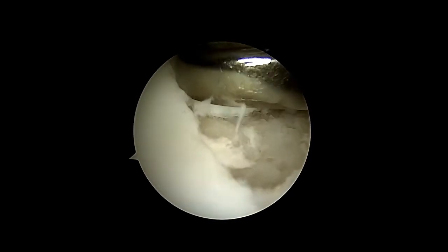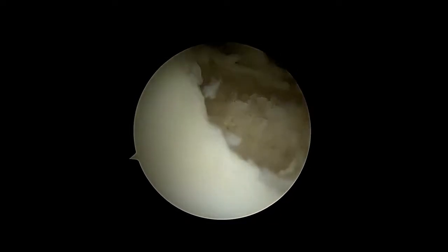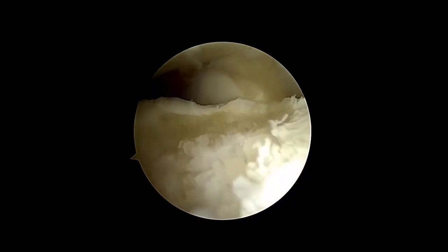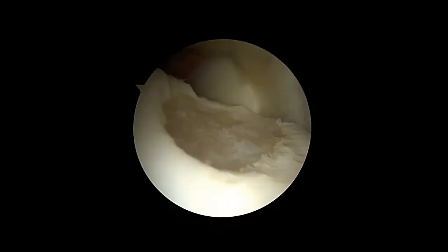Start collecting chondral particles by using the 3 mm Saber shaver blade. Use the vital delaminated cartilage first. If necessary, use a curette to generate a healthy cartilage rim. Additionally, it is useful to harvest cartilage from the defective edges.